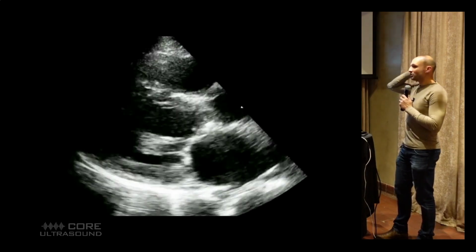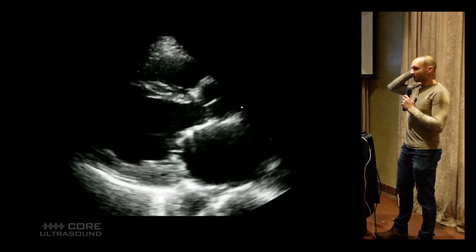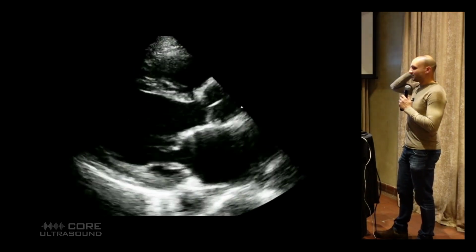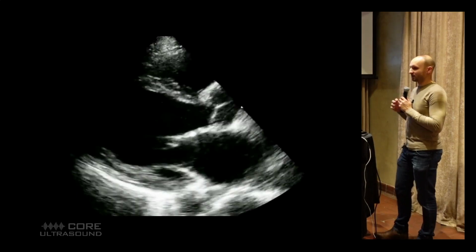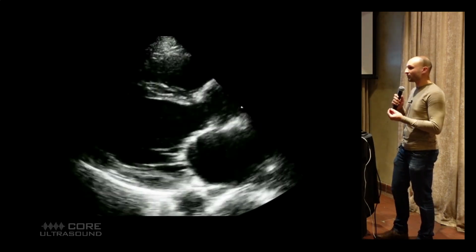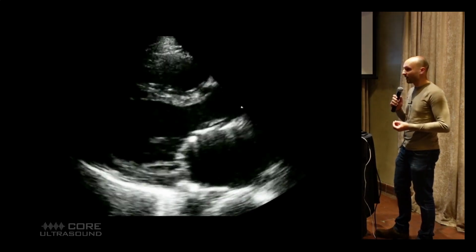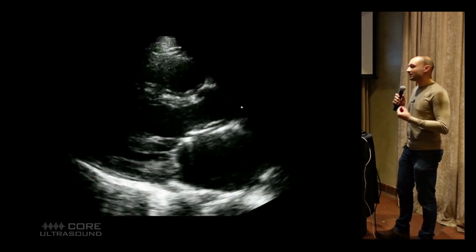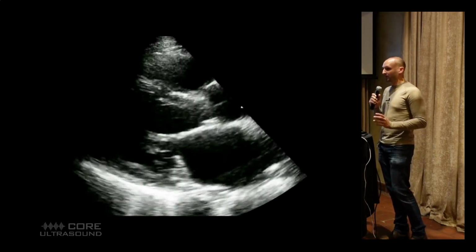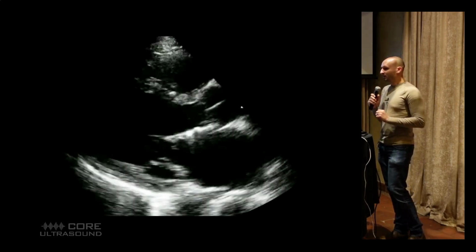Now, what would you do with this? Would you resume compressions? Would you stop compressions? This is tough, right? This is a very low ejection fraction, but I don't know what the patient's baseline ejection fraction is. I don't know if this is enough to perfuse the brain. I have no idea. This is a really good example for why those art lines are so important. The art lines really are the big tiebreaker for this kind of thing. All right, does anybody have any questions? There's a lot of data.